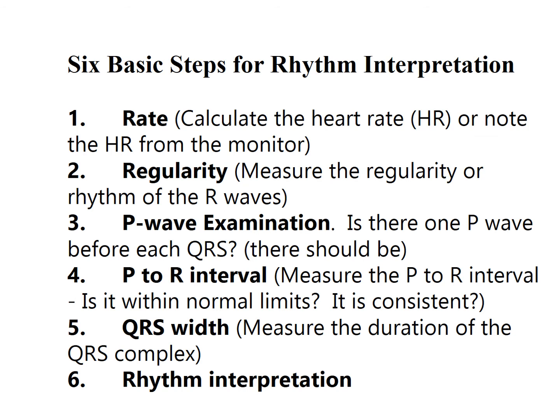So there are 6 basic steps for rhythm interpretation. I'm going to print this out and give it to you guys in class also, because I recommend that you have this with you. If you go through this every single time, you should be able to interpret your basic dysrhythmias.